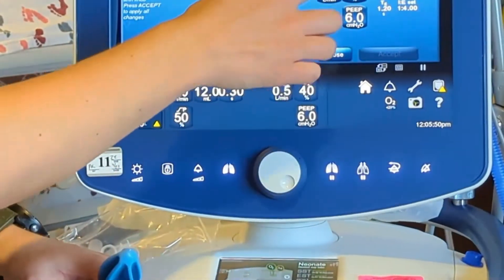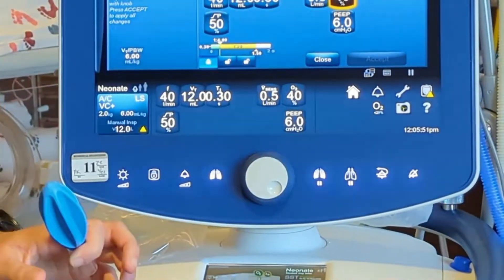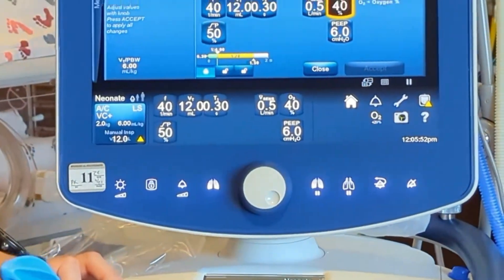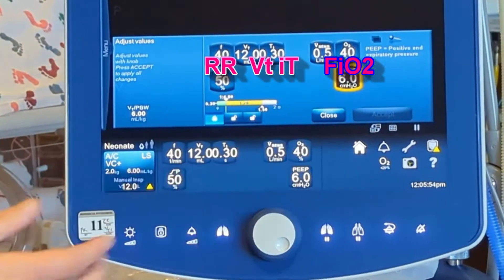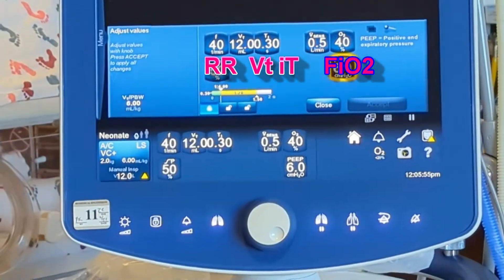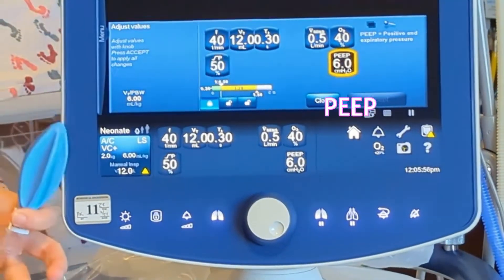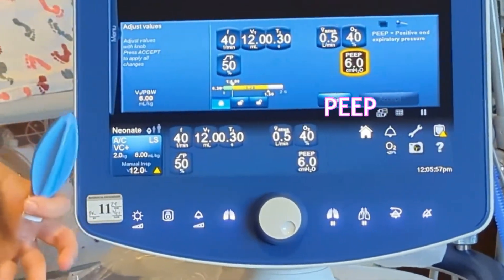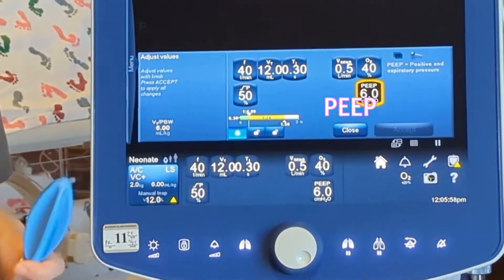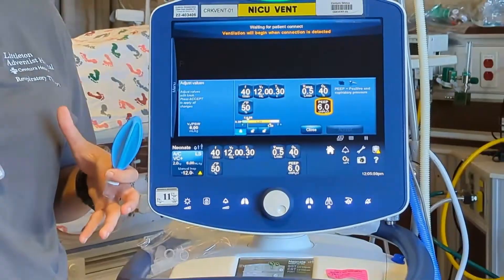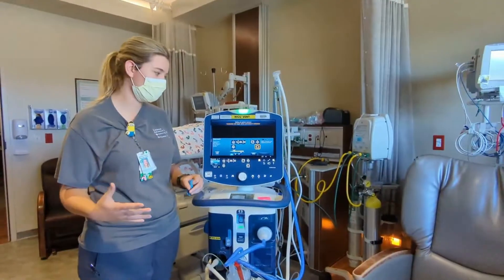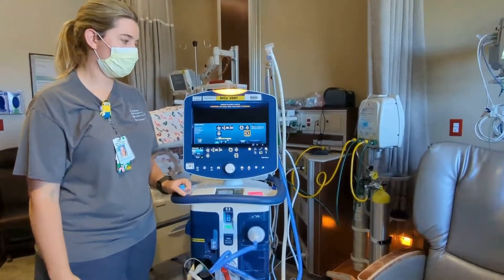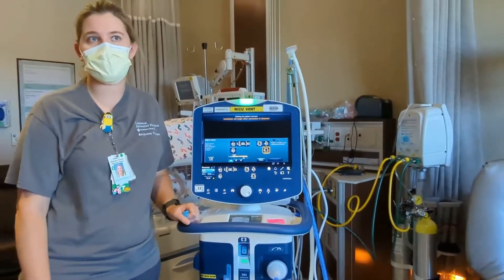And then our FiO2 — how much oxygen the baby is receiving. And then our PEEP level. Is everyone familiar with PEEP? It's positive end-expiratory pressure — like a splinting pressure to keep things open on exhalation. We'll typically start around 6.